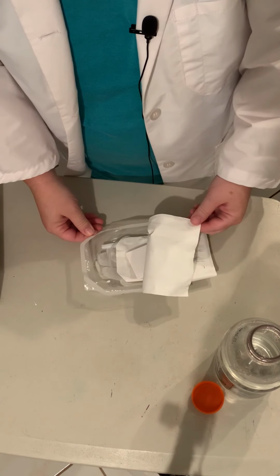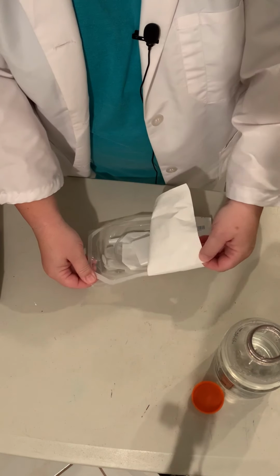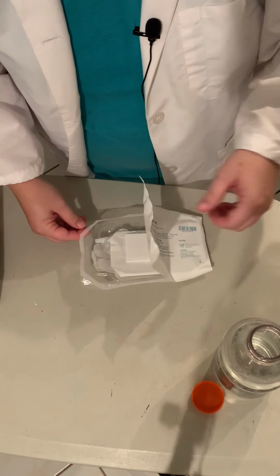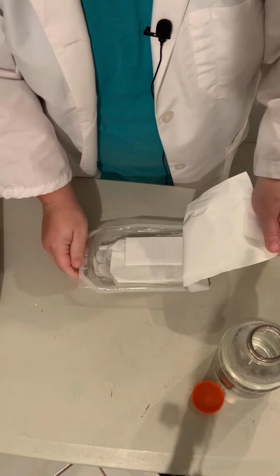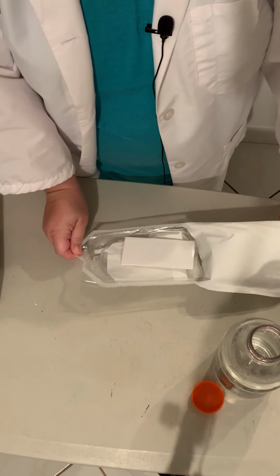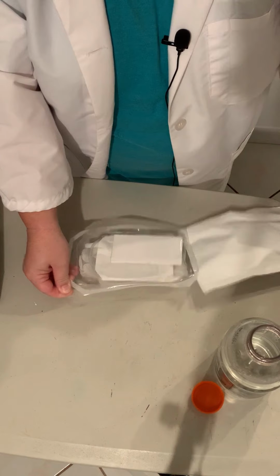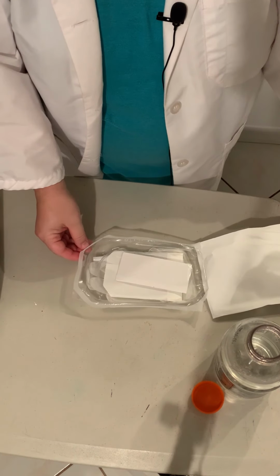And you want to make sure you don't touch the inside of this cover and you don't want to touch past that glued edge. And you don't want the supplies inside to touch past there either. If your supplies do shuffle around and touch, make sure you let the instructor know or go get a new kit because you want everything to be sterile. Oops. Okay, so we've got that open.